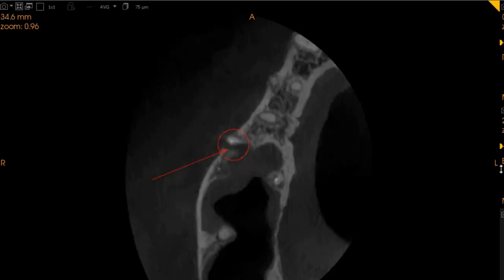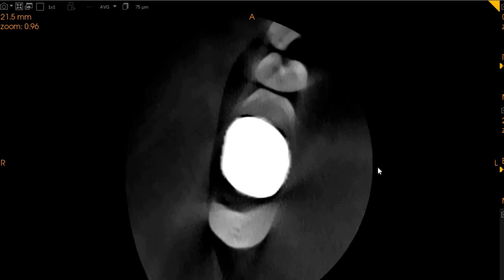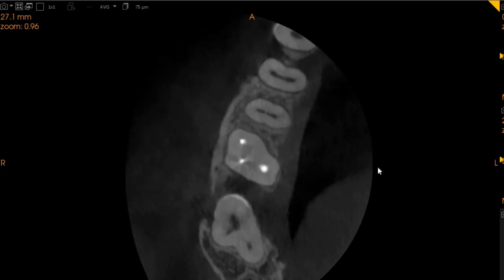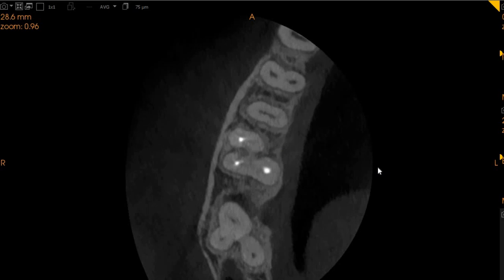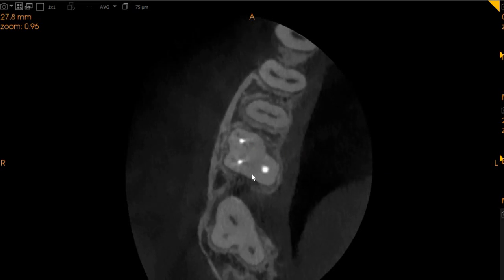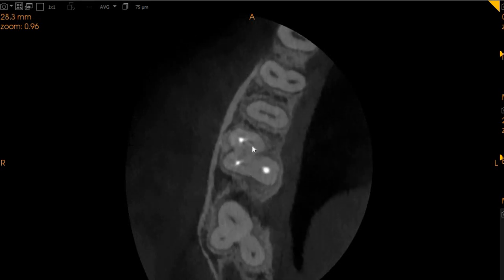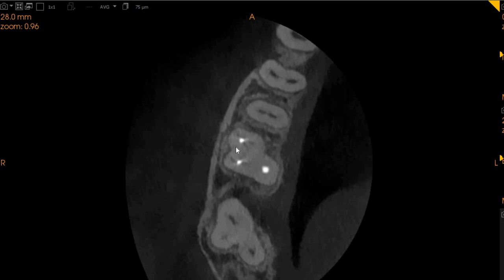This is the axial view, which has shown us a lot of very interesting things. As we move from the crown portion towards the apical portion, we can see three canals obturated: the MB1, distobuccal (DB), and the palatal. But here we can see there is a presence of an MB2.